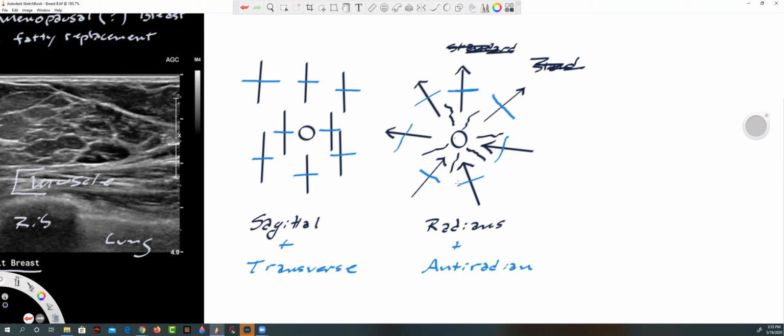Now, maybe other sonographers don't do this. It wouldn't matter that much, because breast tissue is breast tissue. It's got to look the same, no matter which direction you're holding it. Granted, if you're near the nipple, the tissue and the ducts tend to go up towards the nipple, and if you're holding the transducer one way and someone else holds it another way, their screen's going to be backwards.